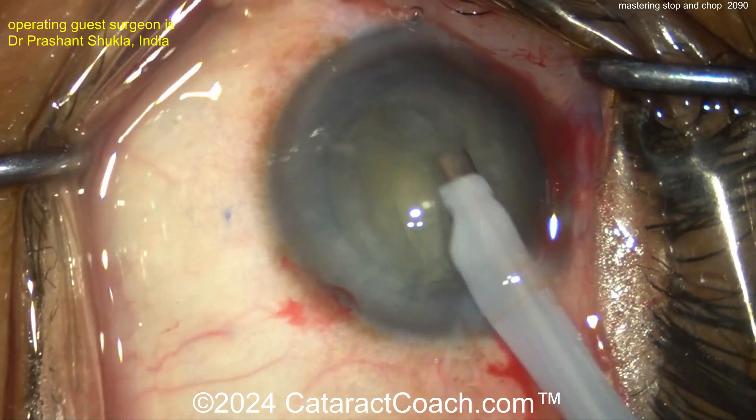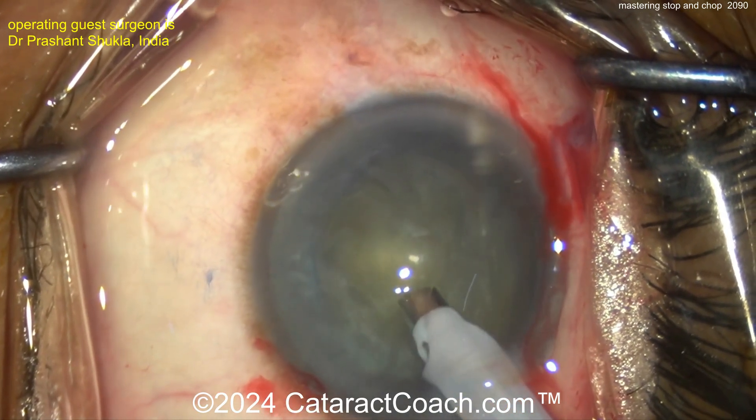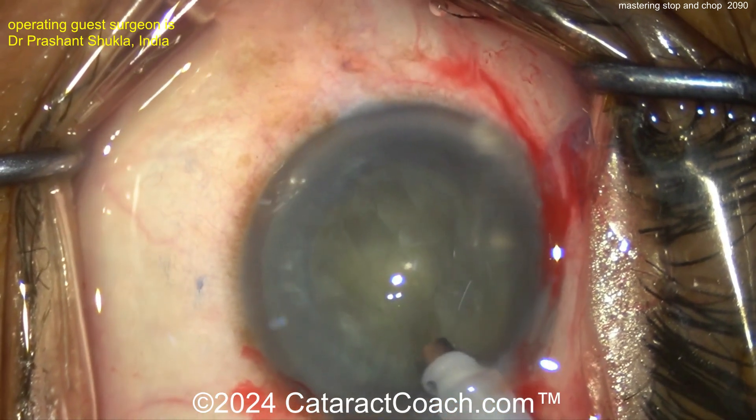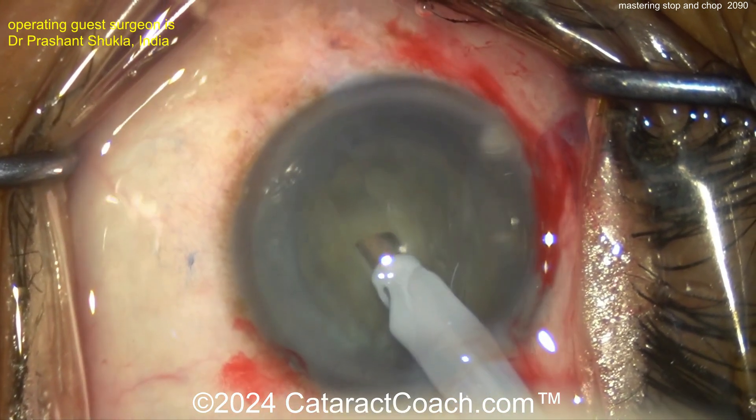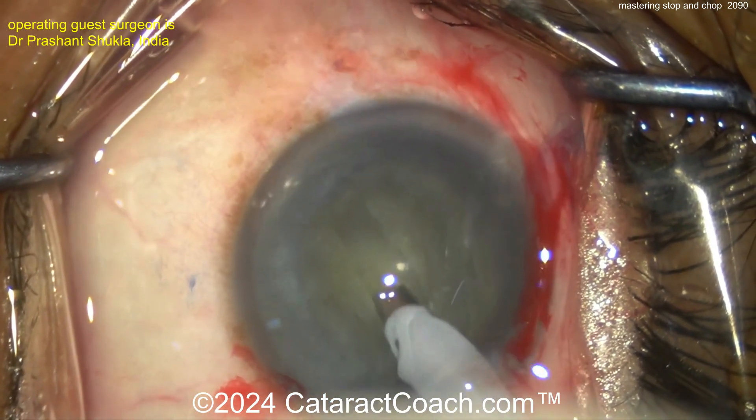Going inside here, cleaning up some of the anterior cortical material. A key here is getting a good capsulorhexis done and getting good hydrodissection. Here comes the groove, like in Divide and Conquer. This groove should be the whole length of the nucleus as well. It should be deeper in the center and then a little shallower in the periphery.